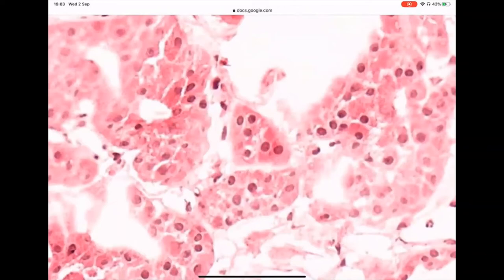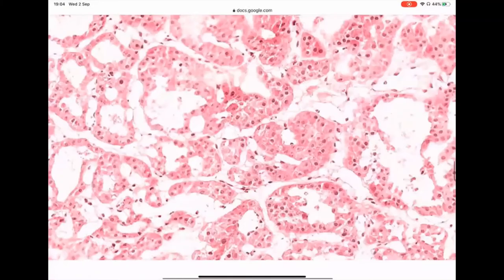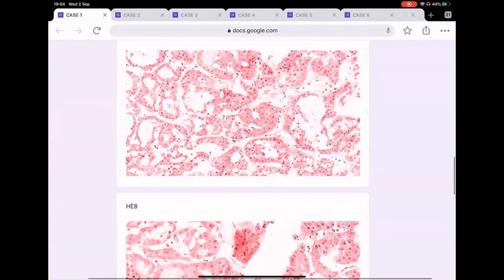If any of you said yes, and did not consider the three options while looking into this case, then you will fail the case in the exam. I'm telling you now, right? Because you can have the eosinophilic variant of the clear cell. This is in the differential diagnosis, which can also have tubules. The clear cell carcinoma can have a tubular and microcystic arrangement, which is one of the morphological spectrum that you see with a clear cell.